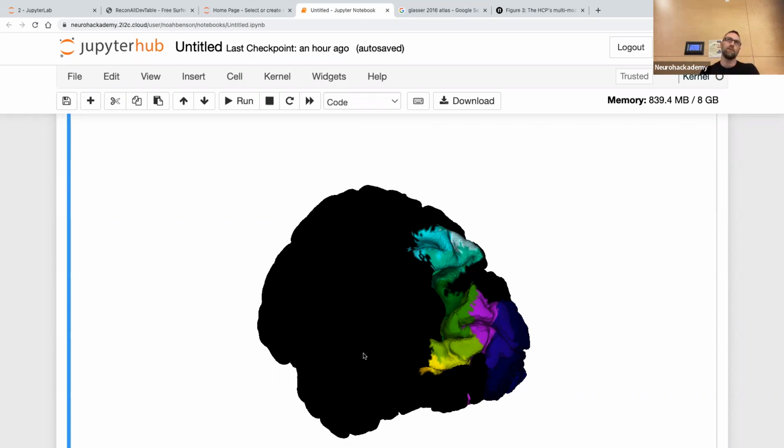Nowadays, I think fMRIPrep is pretty good at minimizing those problems. But nonetheless, there are always risks when you interpolate. And those risks apply equally to whatever you're solving for, whatever you're turning your time series into. So if you start with time series in voxels and turn it into beta weights, and then interpolate the beta weights, you run that risk on the beta weights. And if you instead interpolate the time series, then you run that risk on the time series. So all that said, in practice, there's very little difference.